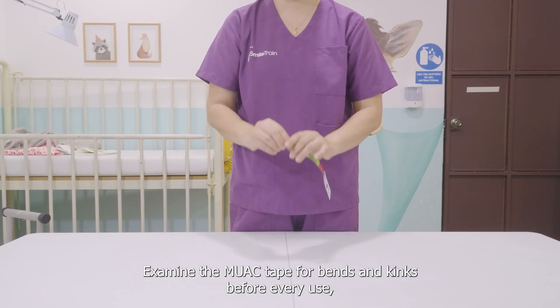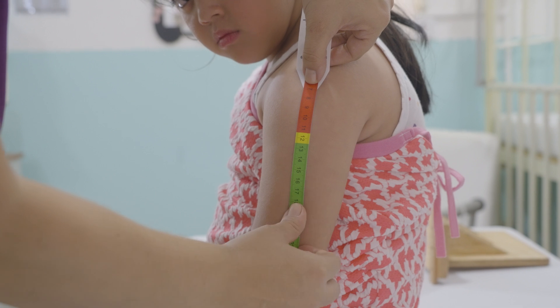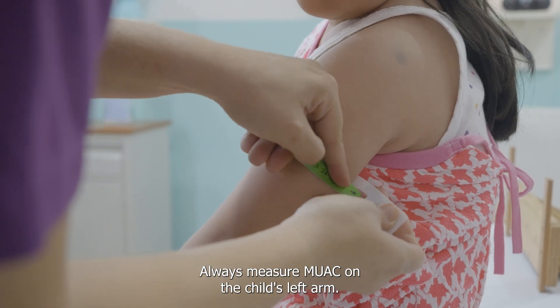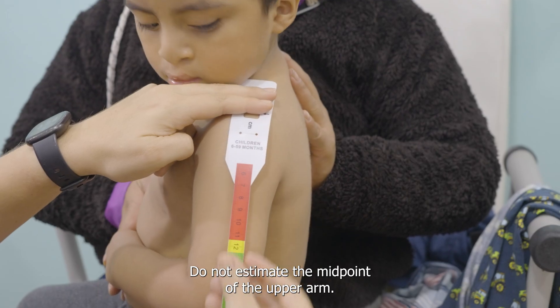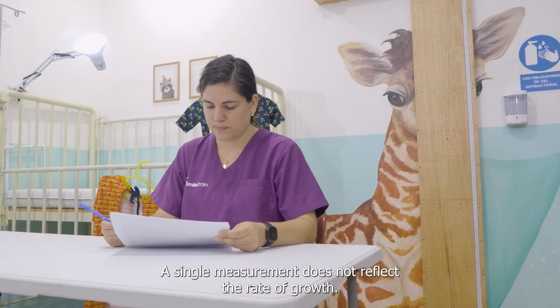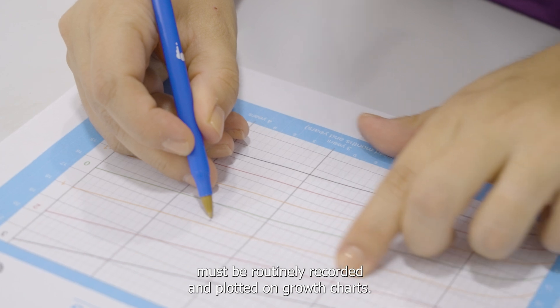Examine the MUAC tape for bends and kinks before every use — a bent tape will not provide accurate measurements. It is very important to take this measurement quickly and accurately while using the appropriate tool. Always measure MUAC on a child's left arm. Do not estimate the midpoint of the upper arm. A single measurement does not reflect the rate of growth; the child's measurements must be routinely recorded and plotted on growth charts.